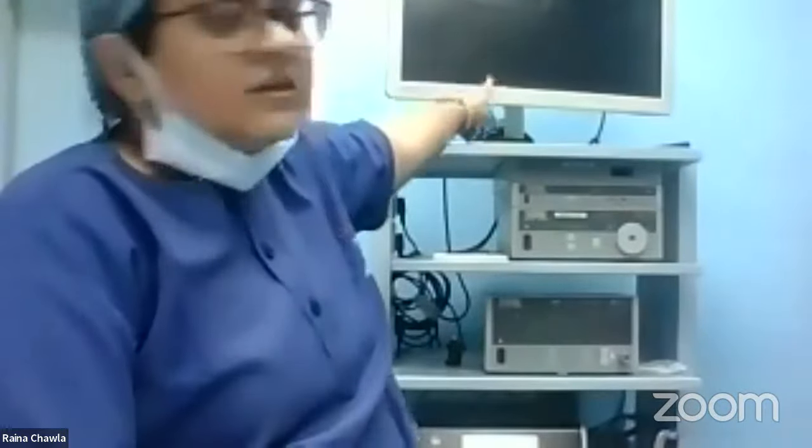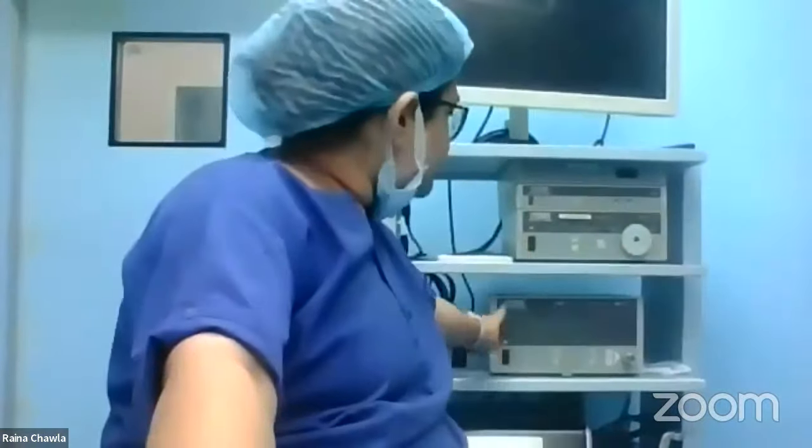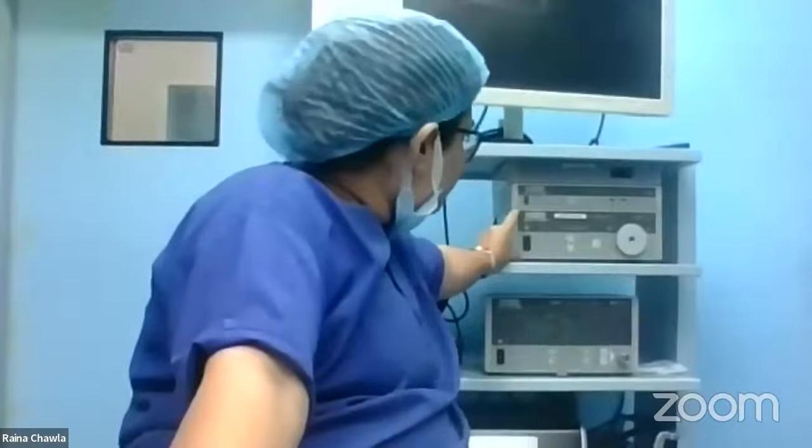I'm sorry. So you can see behind me the laparoscopic system. On top is the monitor. This is where we see the image. Then the top part is the camera system. This bottom part is the light source, because to see inside, we need light. And this is the insufflator through which we get carbon dioxide gas into the abdomen. So the monitor, the image, the camera system, the light source, and the insufflator are on the laparoscopic tower.